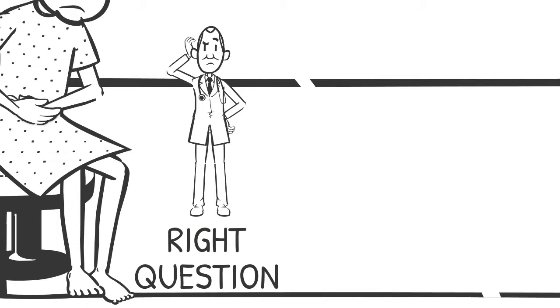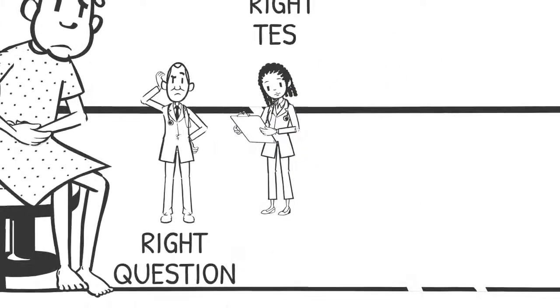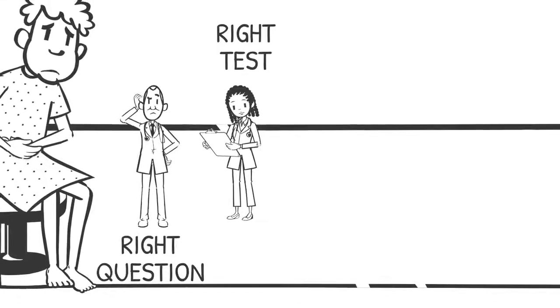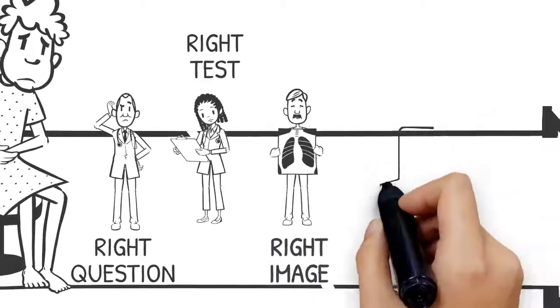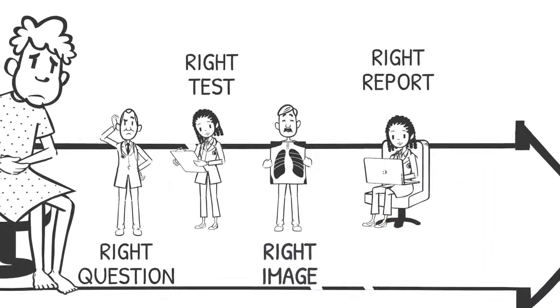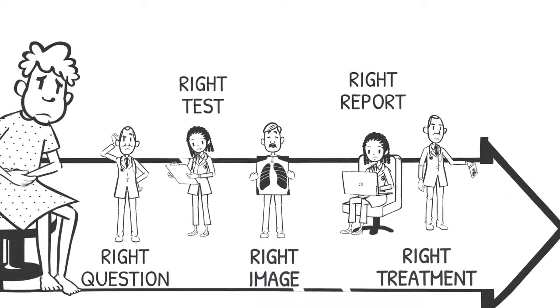I also ensure that no other tests, such as ultrasound or MRI, which don't use x-rays, could give me that answer. As the radiologist, I ensure that the benefits to you are greater than any risks before I allow the scan to go ahead. As the radiographer, I make the best use of my equipment to get the information to answer your health question. As the radiologist, I provide a report that answers the referrer's question. As your doctor, I can now decide on the best way to look after you, my patient.